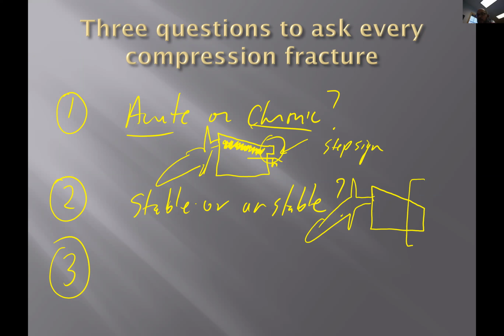If only the anterior vertebral body height is involved, but the posterior vertebral body height and the posterior elements are not involved, only one column, the anterior column, is compressed, and the posterior vertebral body height is the same compared to the levels above and below. It's stable. It's not unstable. It's not going to probably have neurologic sequelae. It's not going to have issues. And it's a stable compression fracture. That's really important.